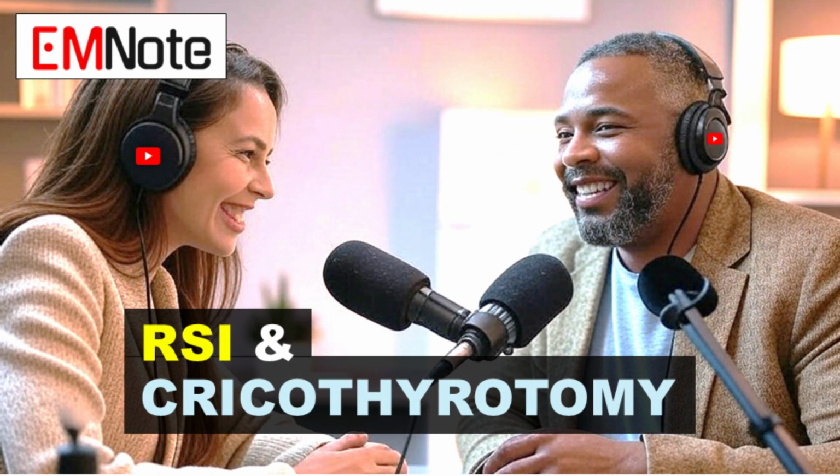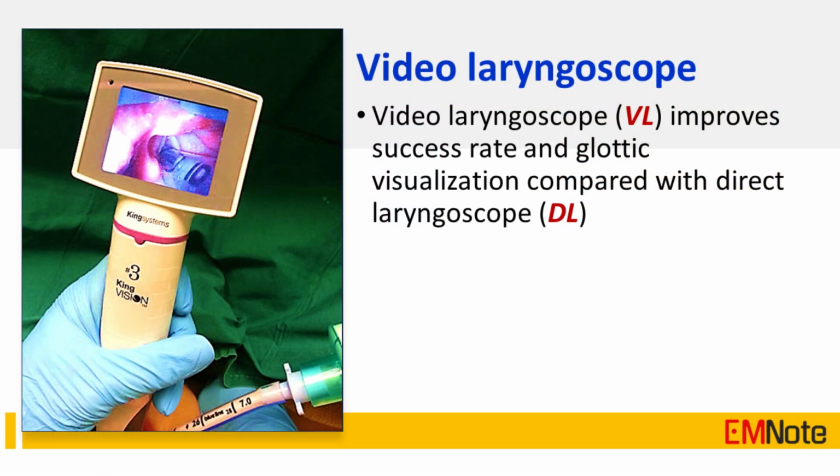So we've established that both rapid sequence intubation and surgical cricothyrotomy are essential skills for healthcare providers, especially those working in emergency settings. What are some of the advancements or innovations in this field that are improving patient outcomes? One significant advancement is the development of video laryngoscopes.